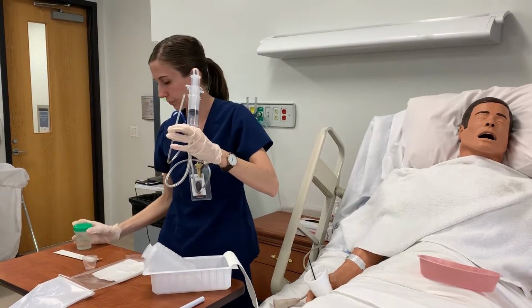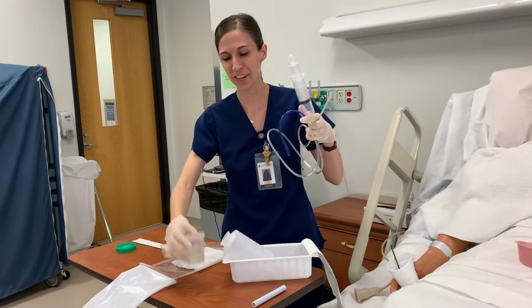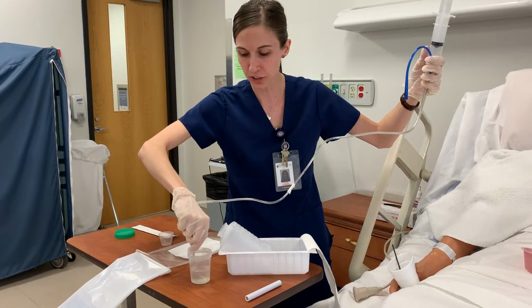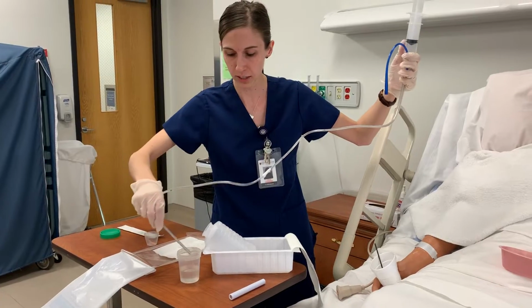And so again, you guys will have somebody holding your lubricant. I just don't have that, so I'm going to do a quick little lubricant. So I'm going to apply lube to the first 4 inches of my distal end of my NG tube.